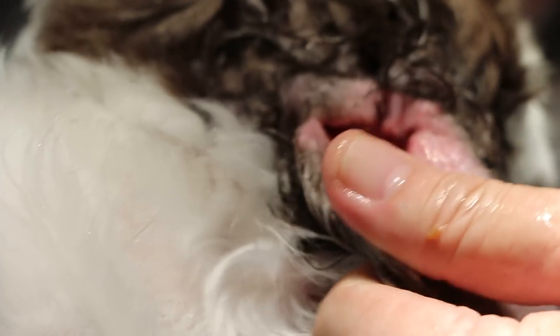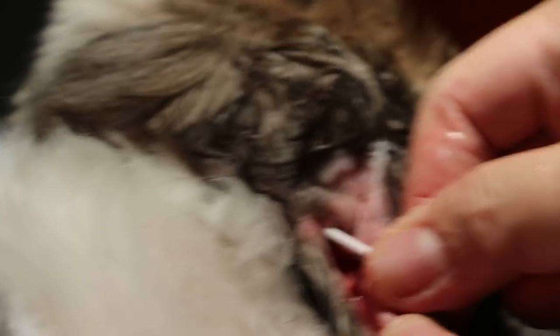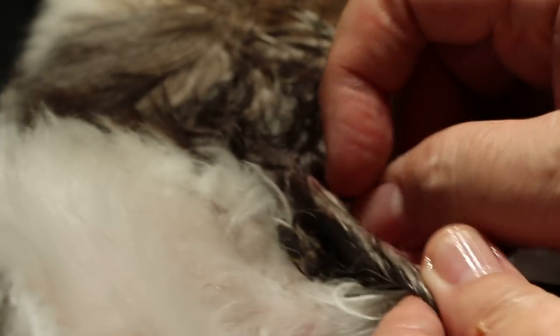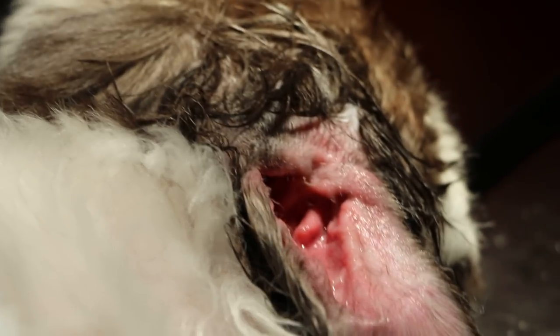Now the dog is going to wake up soon. There is a bit of dirt here — this could cause irritation. I'll use a cotton swab to check for any bleeding. Very clean, just some brown wax on the side, but not much. That should be okay.